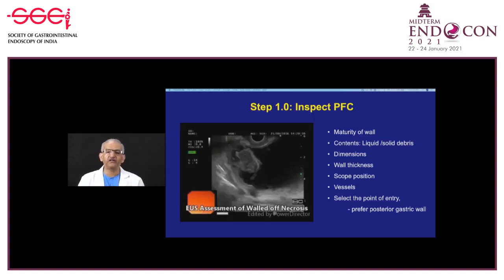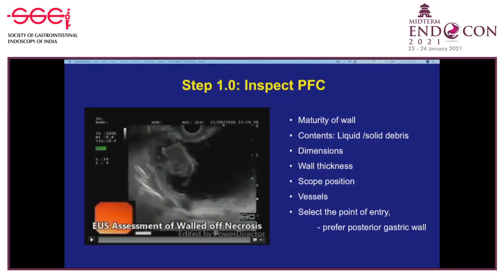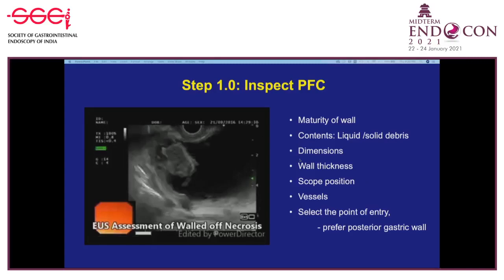The EUS-guided drainage procedure is divided into five steps. Step one—inspection—is very important. We inspect the collection to know maturity, content, and to measure the longest dimensions in both anteroposterior and lateral planes. We also measure wall thickness, find out the scope position (long position makes accessory passage more difficult), check Doppler for vessels, and then select the point of entry.